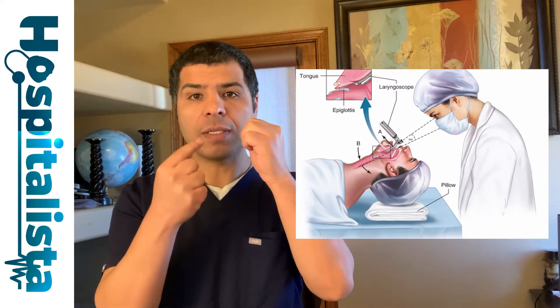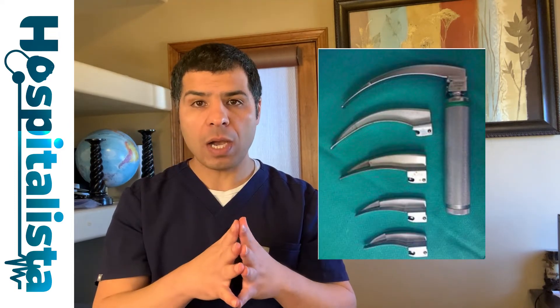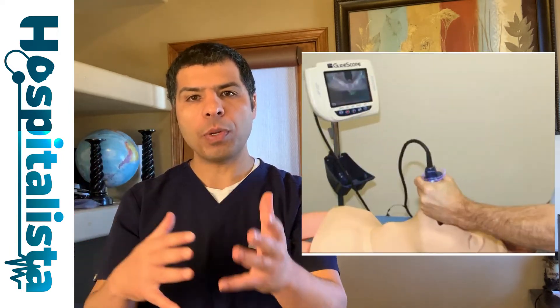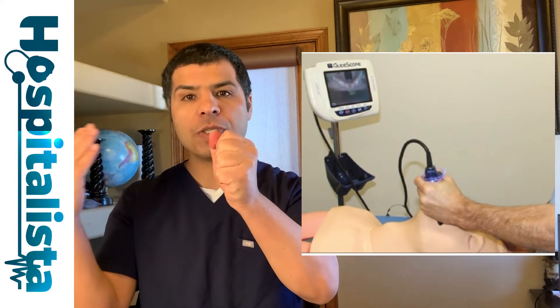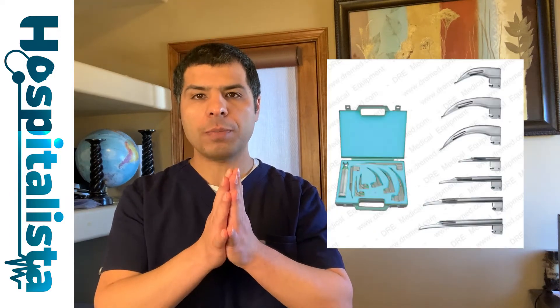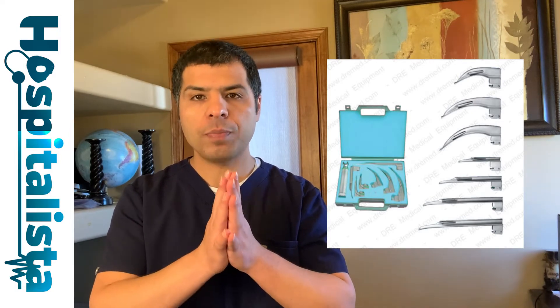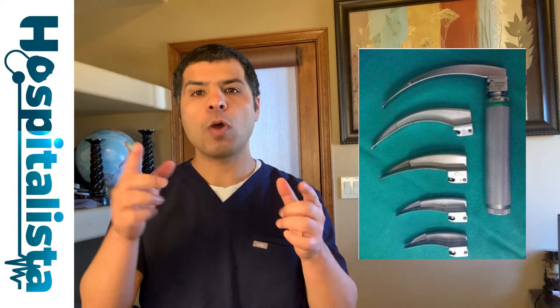Laryngoscopy can either be direct or indirect. Direct means you use the laryngoscope and take a direct look with your own eyes — the laryngoscope has a blade and a light source. Indirect means you use the blade with a light source but view the airway structures indirectly, most commonly by looking at a screen. The blade has a light source and a camera, allowing you to see the structures on a screen instead of looking directly into the airway.